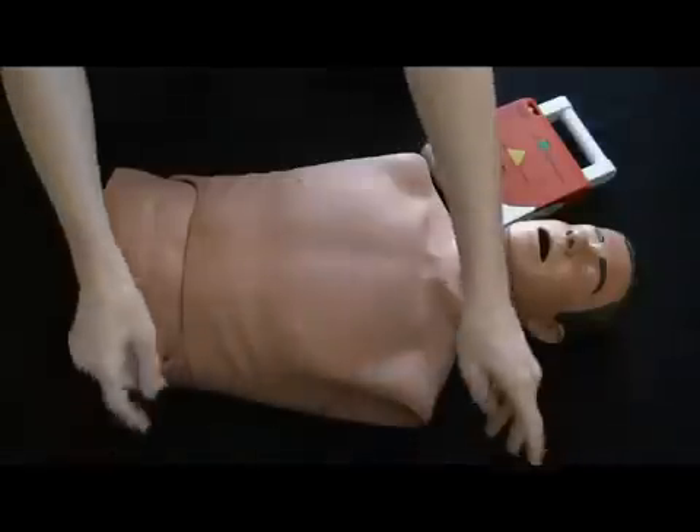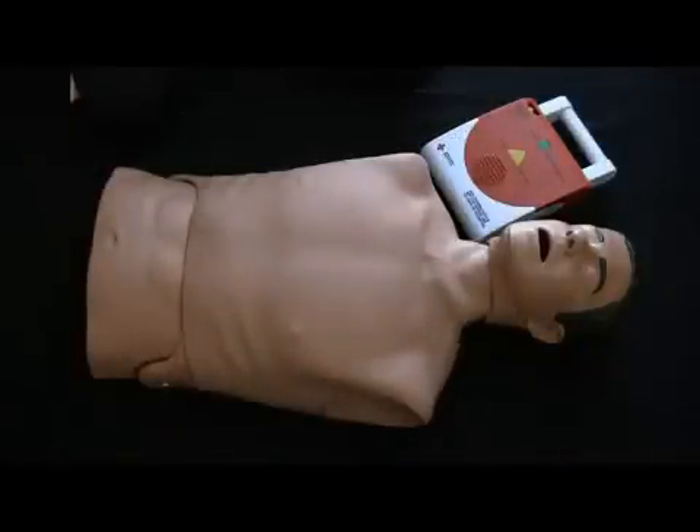Remove clothing from the person's chest. Attach pads firmly to the person's chest as shown.